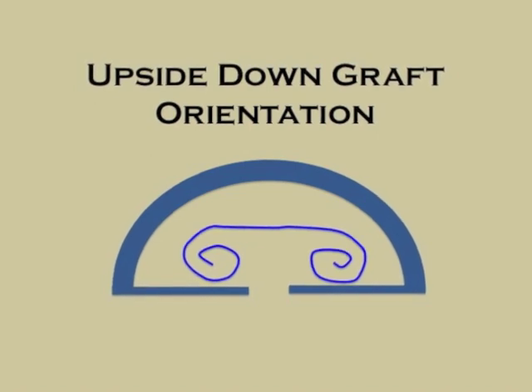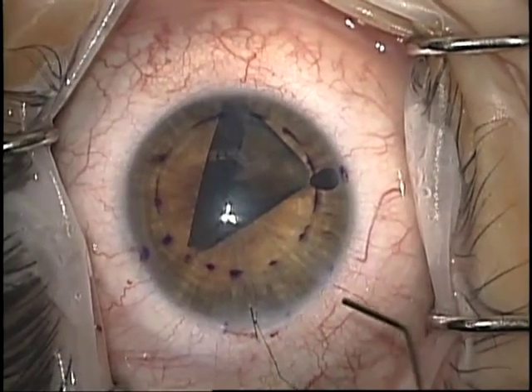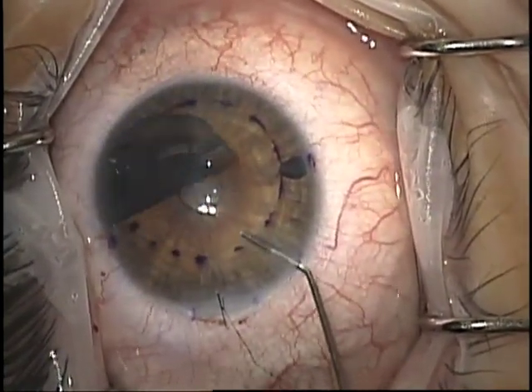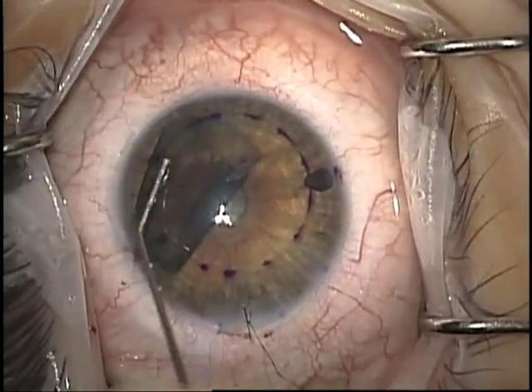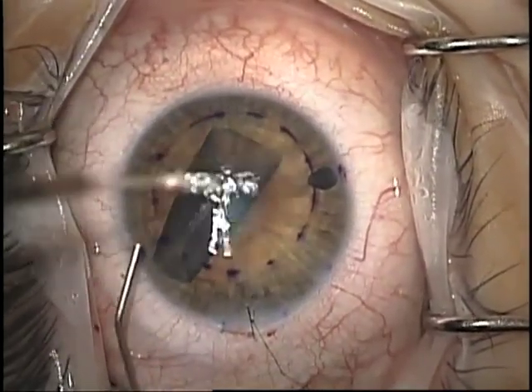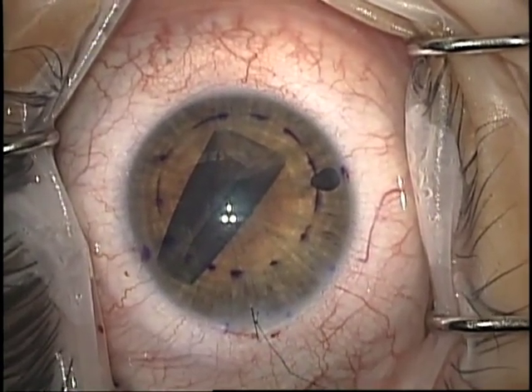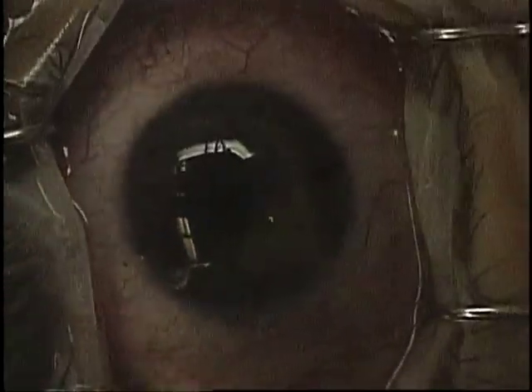In this case, I determined the graft was upside down, as shown in this diagram, so the graft had to be flipped over. This is accomplished with fast bursts of balanced salt solution along the iris plane or along the curve of the cornea. I usually choose along the iris plane, and you can see the graft flips over nicely. I then re-center the graft, turn off the microscope light, and use the handheld Eidolon slit beam to assess graft orientation again. This time, I can see that it's now in proper orientation and I can proceed with the rest of the surgery.